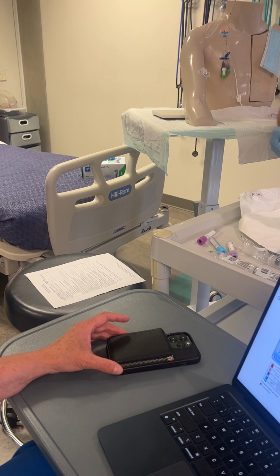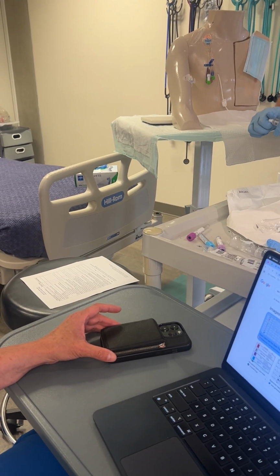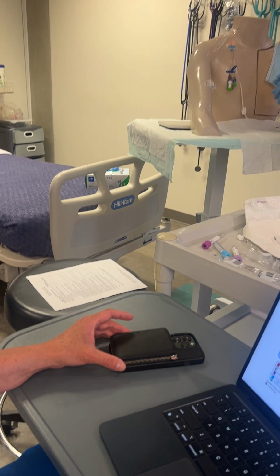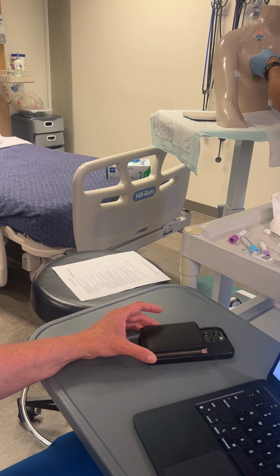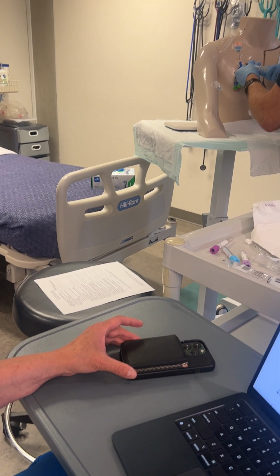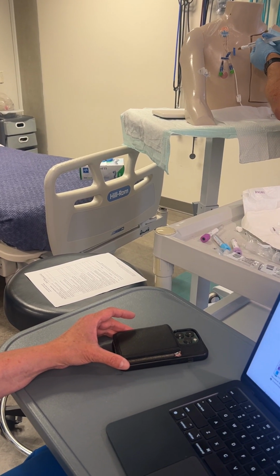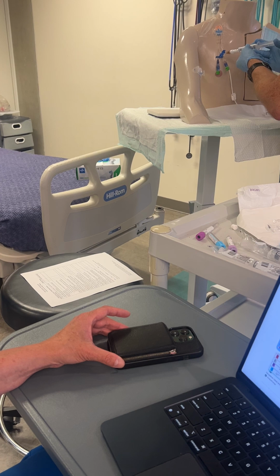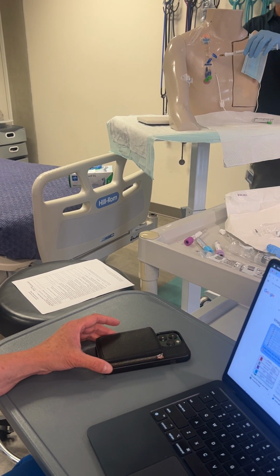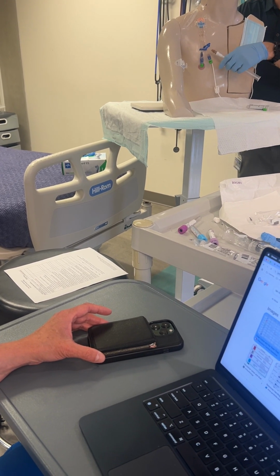I got my tubes. Got my flush. I've got my order. All right, I'm getting the air out. So this is locked. So I'm going to flush. And then I want to check blood return. I don't know if this will actually work. It's locked. I'm not trying to push on it yet, but no, this will just make a big mess.